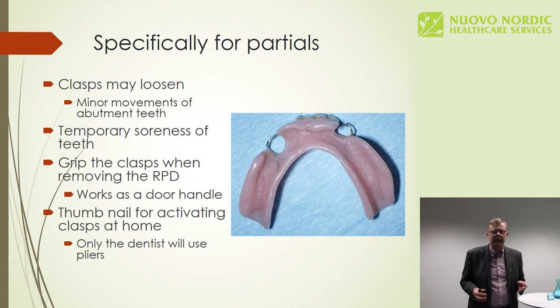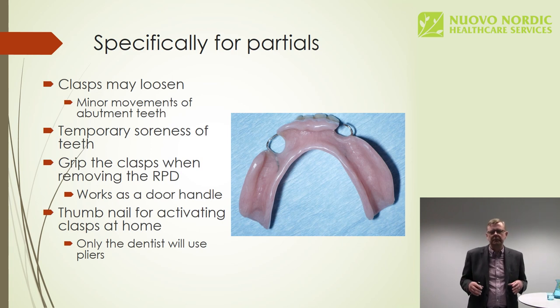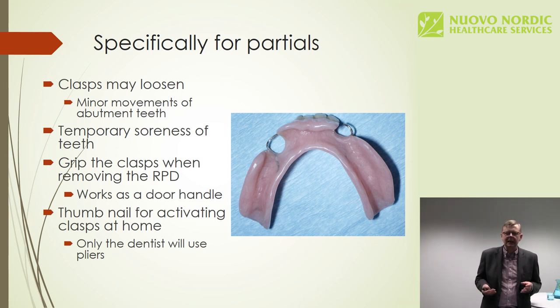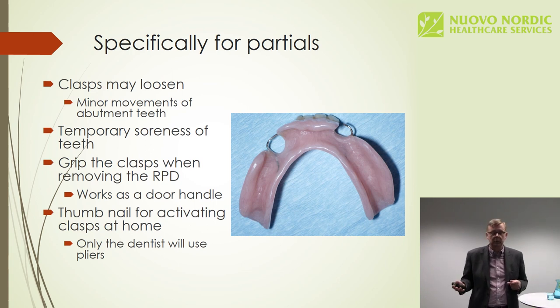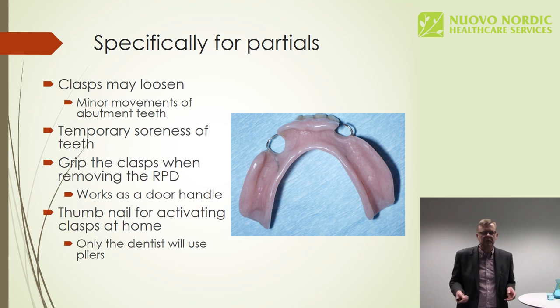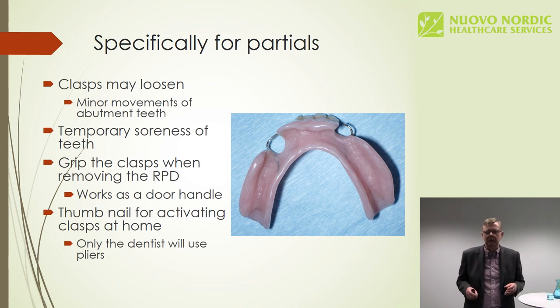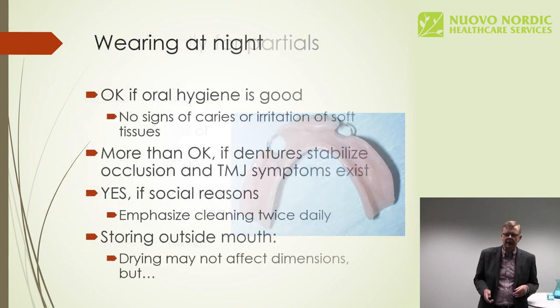When we have a partial denture and we have the clasps holding the denture in place, the remaining teeth may be a bit sore in the beginning because the clasps will push the teeth against the denture, and at this time also the denture may become a bit loose. However, you will tell the patient that you will activate the clasps at the control visit. The patient can also try to activate the clasps him or herself at home. Every time the clasps get loose, the patient doesn't necessarily have to come to see you. He can try to do it at home. However, you have to make sure the patient will do that very carefully.